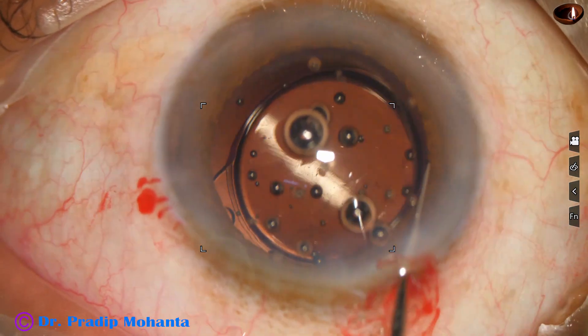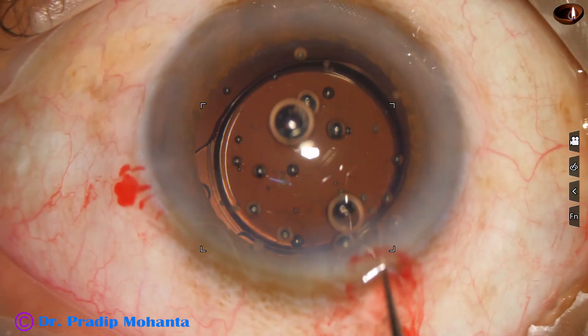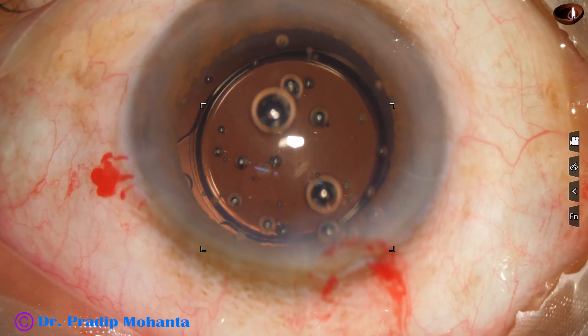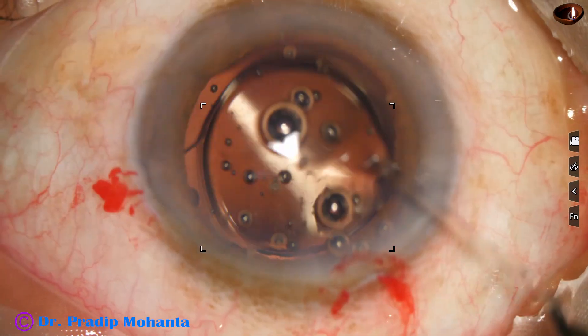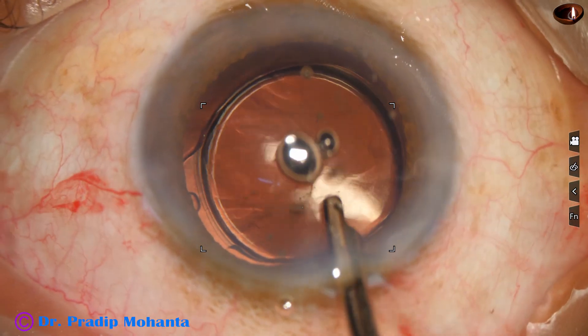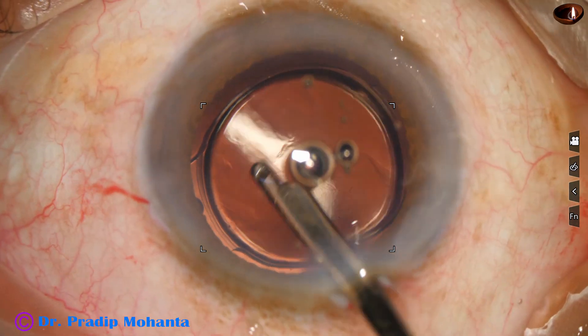The lens has gone into the capsular bag. This Seema hydrophilic intraocular lens — a beautiful lens — has gone into the capsular bag. Haptics are at 3 o'clock and 9 o'clock, or perhaps 8 o'clock and 2 o'clock position.